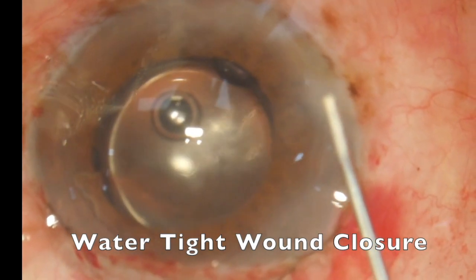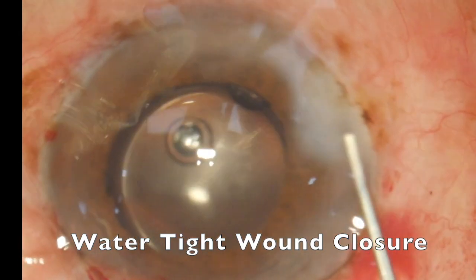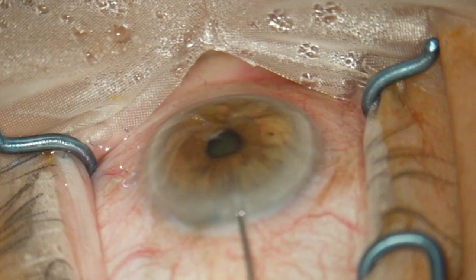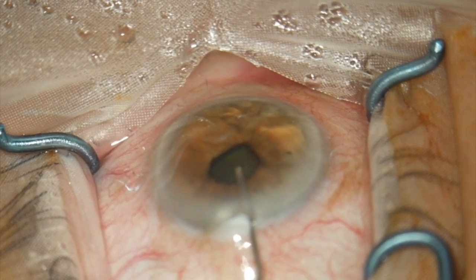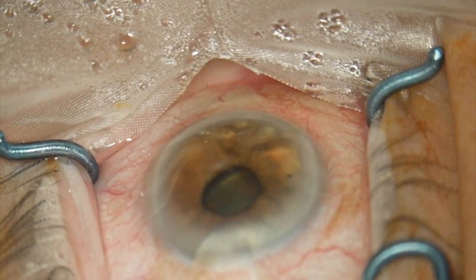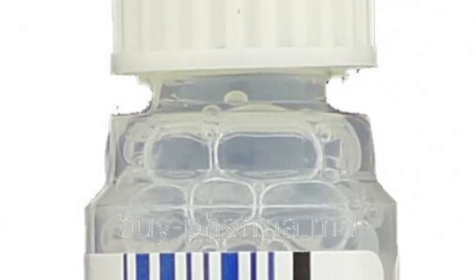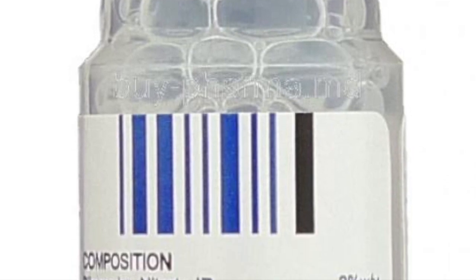At the end of the procedure, close the eye and make it watertight. You should leave about 30% viscoelastic in the anterior chamber to help tamponade the ablation site and minimize reflux bleeding from it. In the end, it's extremely important to counsel your patients well. Prepare them for a few days of blurriness and taper off the prednisolone quite quickly. I prefer to use post-operative pilocarpine in my patients about 4 times a day for a couple of weeks to help keep the iris away from the treatment site.